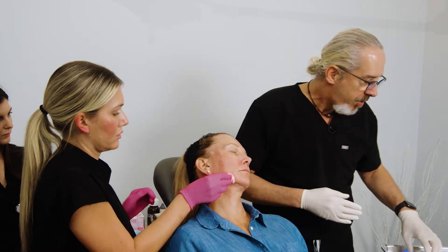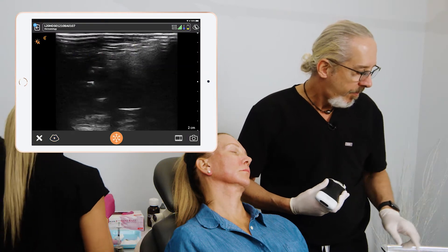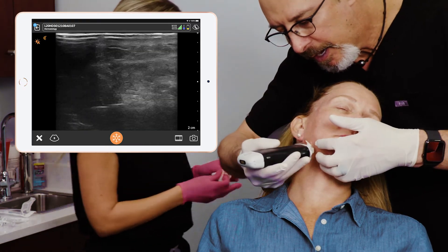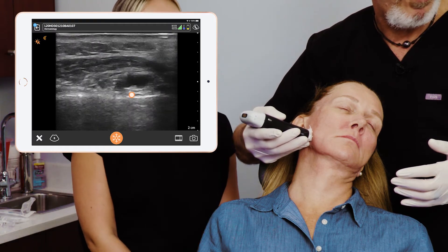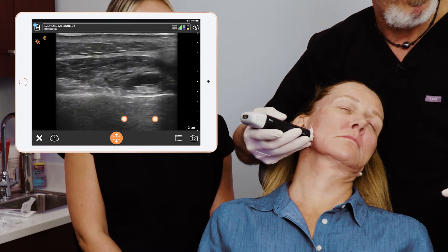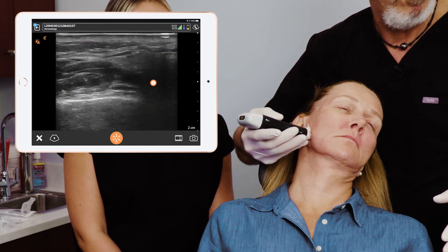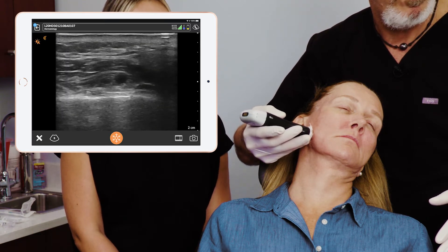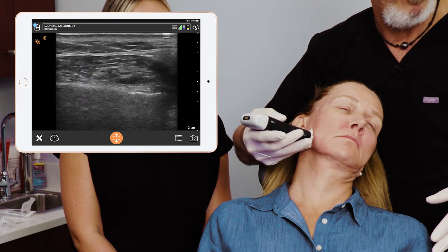It's pretty avascular there. So now let's confirm the placement using our B mode. Let's go and take a look at the injection. There we see a nice bolus on the periosteum. We see a nice posterior enhancement from the bolus. Just a little posterior you see the other one too. There are the two areas of bolus of the HA. We're going to now do the other side.